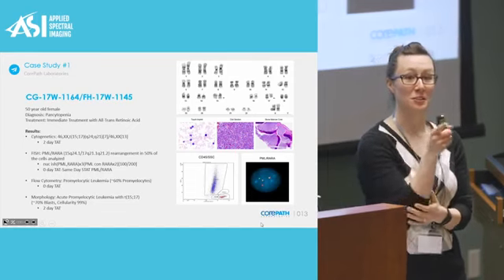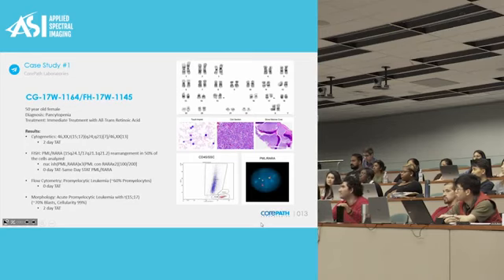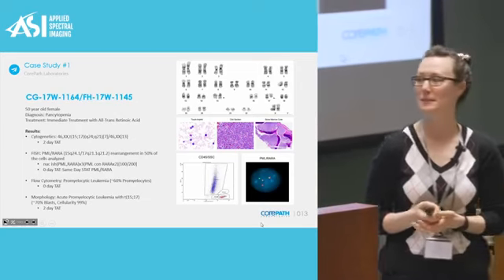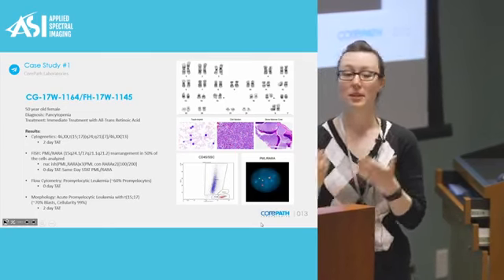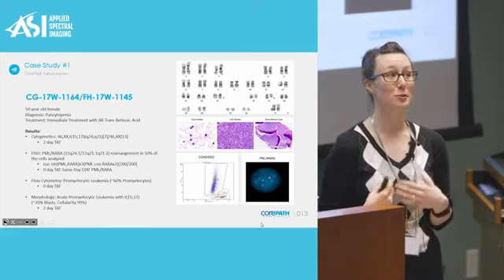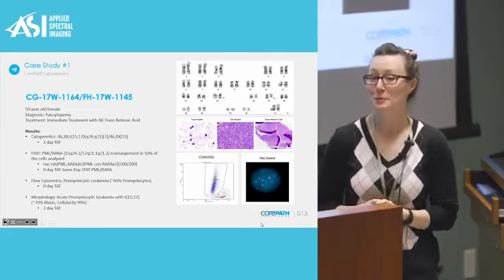So I'm going to ask a question of the audience. Why is that important? Very good. Can everyone hear them? If they don't get treated appropriately, they could bleed out. It affects coagulation. So because of our digital system, because of our automation in our laboratory and the probes that we're using, we were able to give life-saving results to someone within the same day and basically save someone's life.